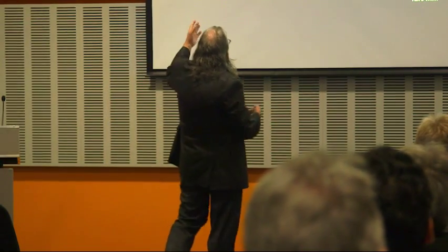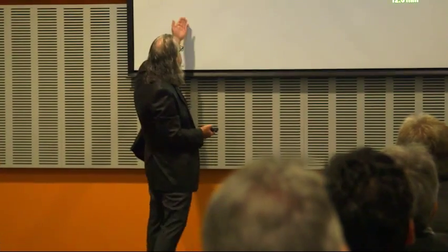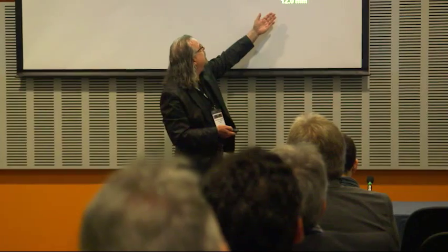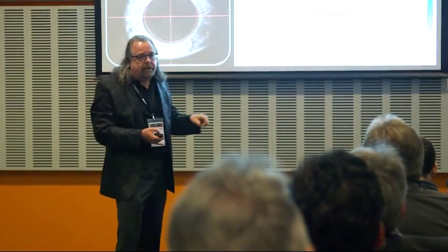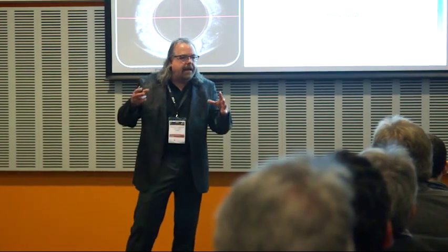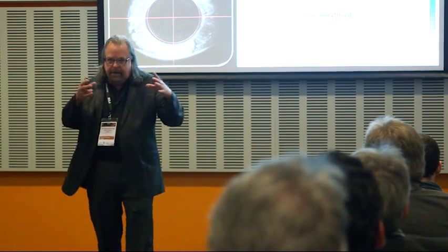And remember this, that we have evolved in the past 30 years from keratometry to photokeratoscopy to video keratography to composite corneal topography. And what it has ultimately done is led us to this room here, where we have now taken it one step even further to get both corneal and scleral shape analysis.